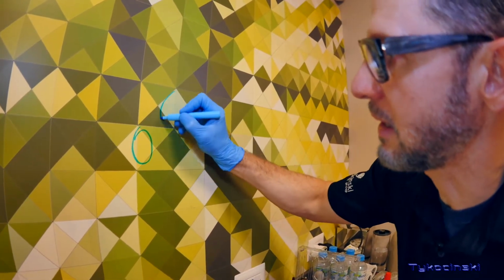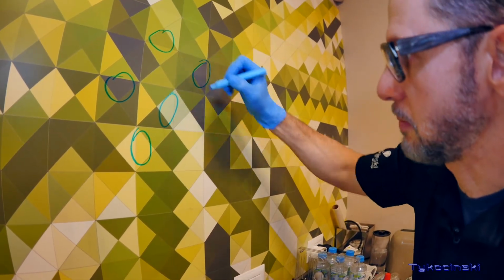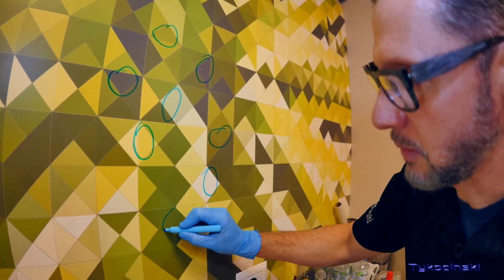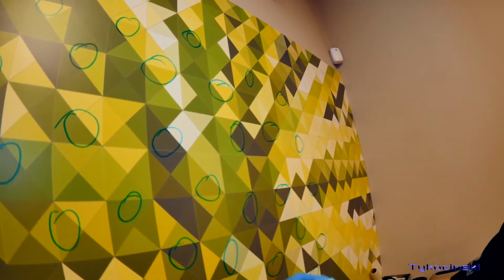We're gonna select individual follicular units. Of course, we're gonna respect some space in between the follicular units because we don't want to over-harvest the donor area. That's it. Seems we got a pretty big session, huh? First session is done. Patient is extremely happy.